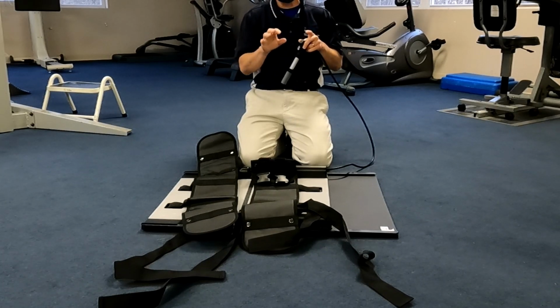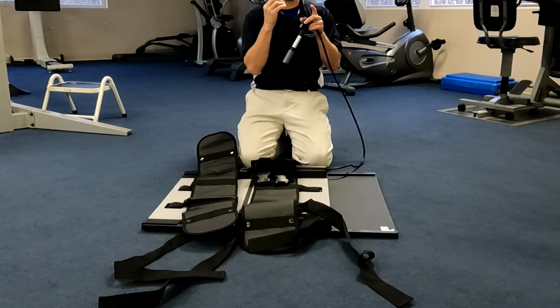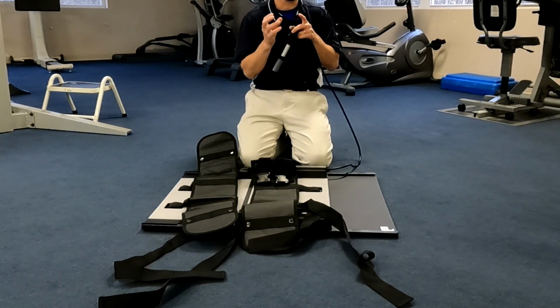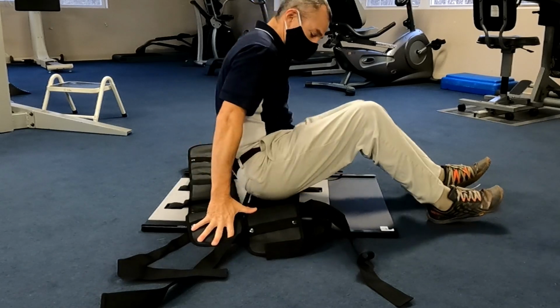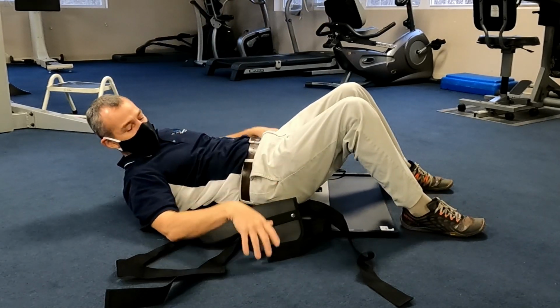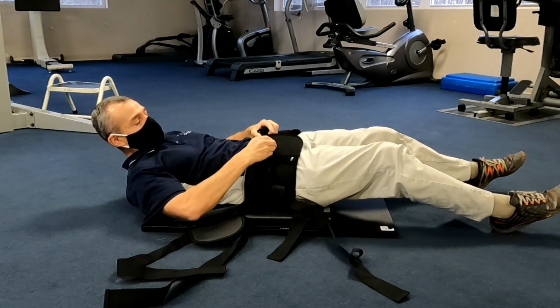We're trying to provide gentle traction to create a little bit of space between the vertebral bodies, but really to try and produce a relaxation effect. So I'm gonna get into position first. We're gonna set you up so that clinically, I want the lower part to kind of come in here.